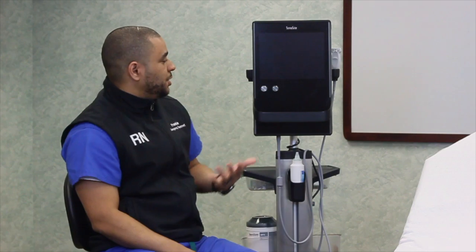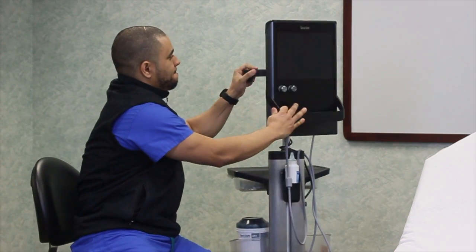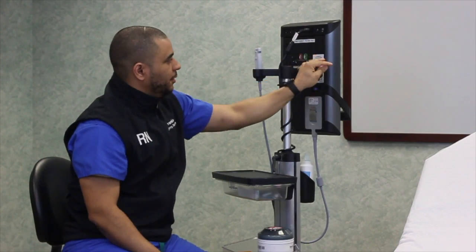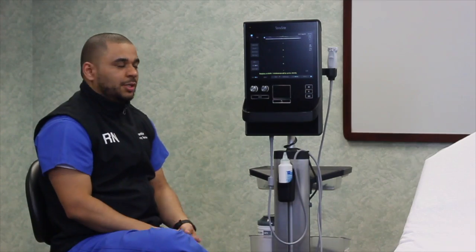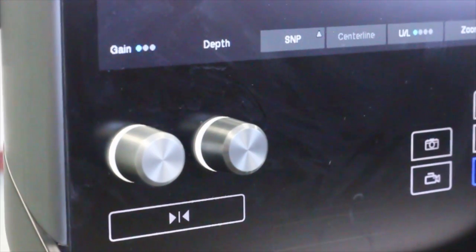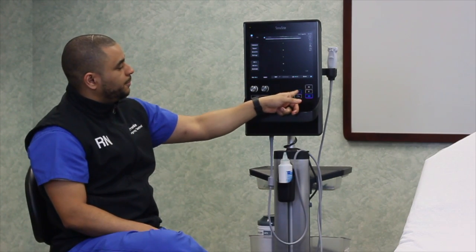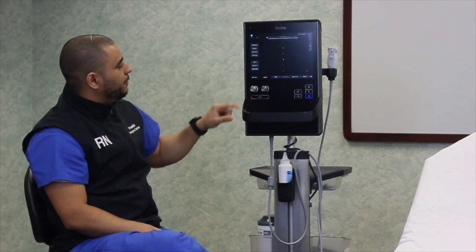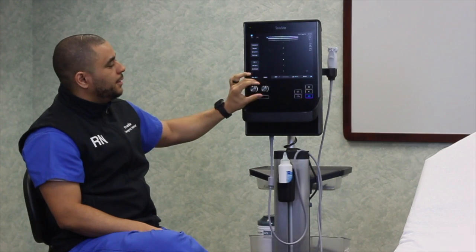Before we go any farther, let's talk about basic care of the machine and basic setup. The machine has a power button in the back. Turn that on and allow the machine to reboot appropriately. On the front of the machine you'll notice two knobs — those are the only physical controls before the machine powers on, as the rest of the machine is touchscreen. These two knobs control the gain feature and the depth.